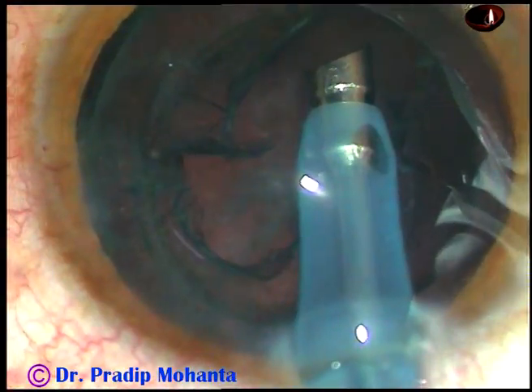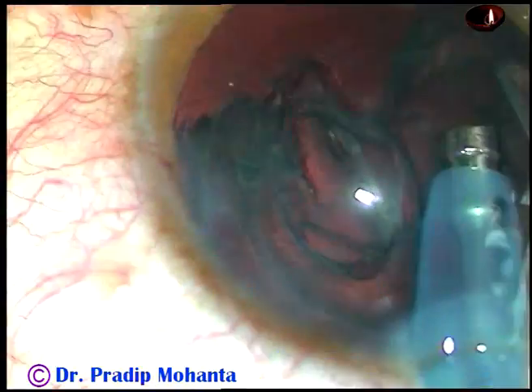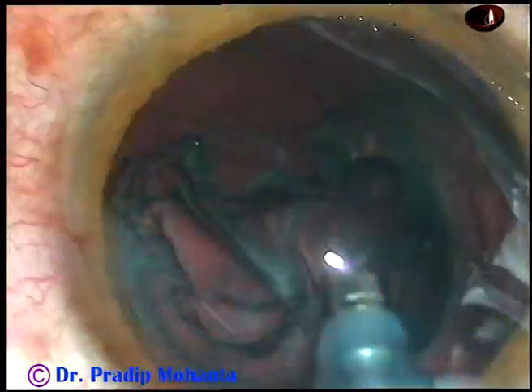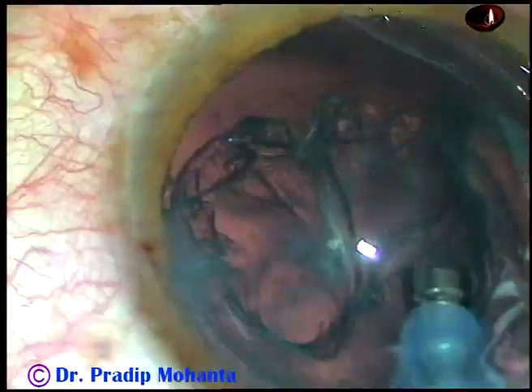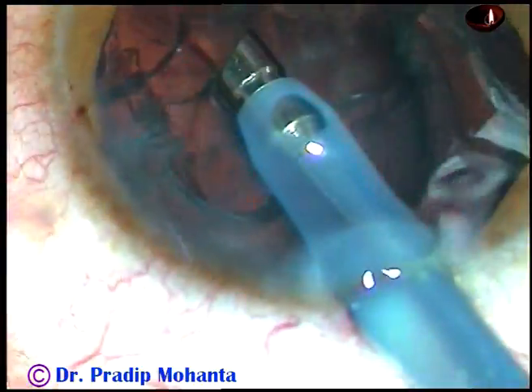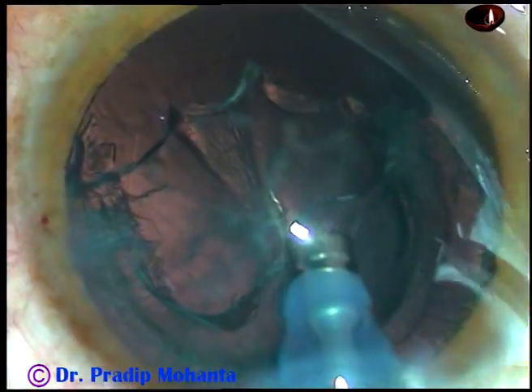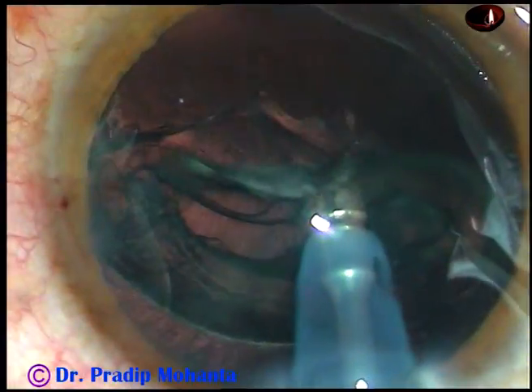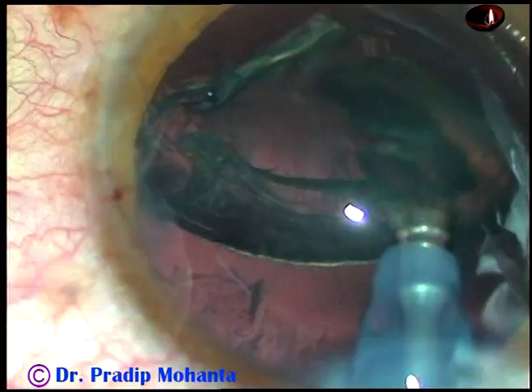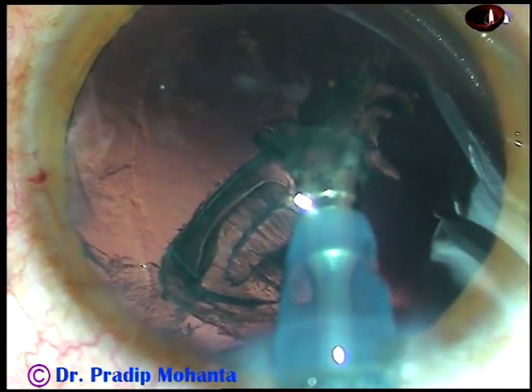In this case, removal of the epinucleus takes longer time than the nucleus because you have to take care of the posterior capsule. You cannot go too far peripherally because you can catch the posterior capsule and make a rent. So be very careful. You can come out, inject some visco behind the epinucleus and remove it safely.